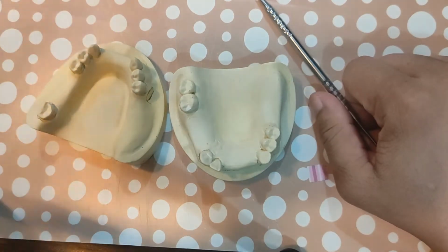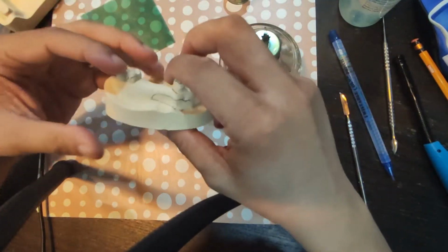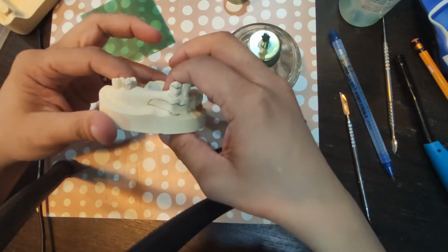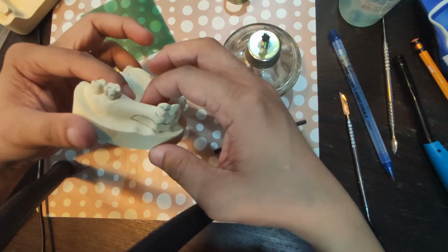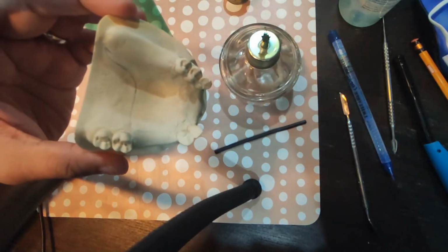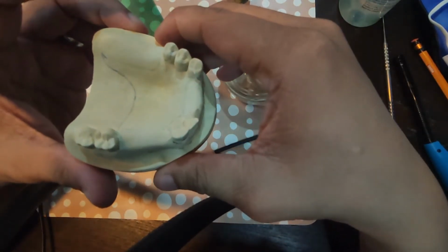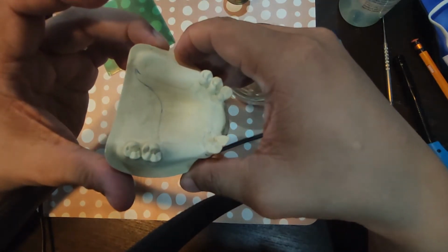Okay, thank you. All right, so now we're going to do the second part of the cast preparation, which is blockouts, relief, and beading. Okay, I don't know if you can see it, but before I start off with my cast prep for the upper, I made an outline of where the framework will lie.